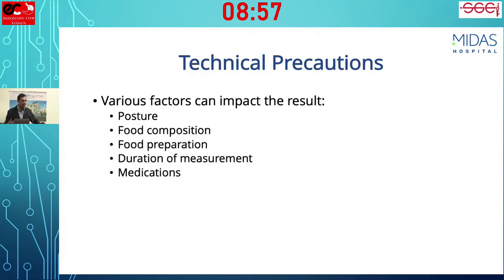Now I'll delve a little more into this because this is primarily the way in India you're going to diagnose gastroparesis, and I'm aware that availability of this is limited and the quality can be patchy. I think it's very important that you understand, if you are planning to do gastric POEM and such procedures, then you need to understand how to diagnose gastroparesis and whether it's done correctly or not.